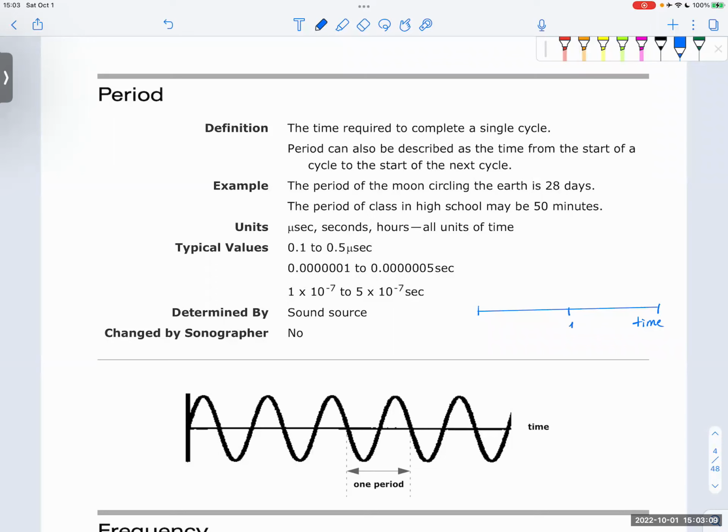And here, this is 1 second, this is 2 seconds, this is the beginning. So now, the first thing we need to identify of any sound or ultrasound is something called a cycle. That is 1 cycle here, as we can see. It's from the beginning to the end of that cycle. That is 1 cycle. Now, this continues.